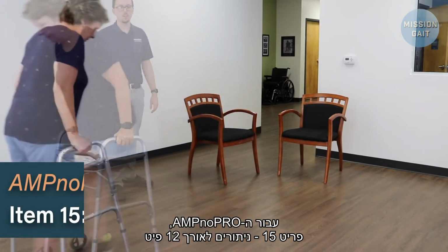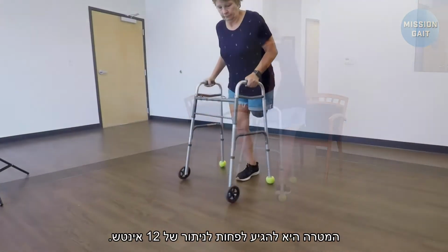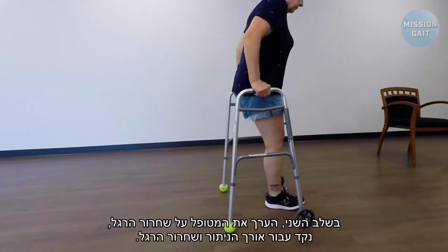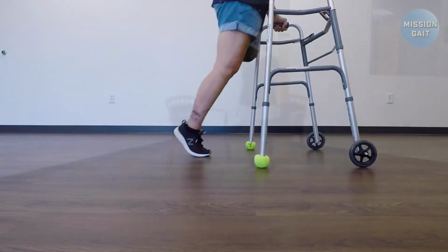For the Amp No Pro, item 15. Hopping 12 feet. As the patient begins hopping, assess the patient's hop length, looking to achieve at least a 12-inch hop. Secondly, assess the patient for clearing of the foot. Score for both hop length and the foot clearance.